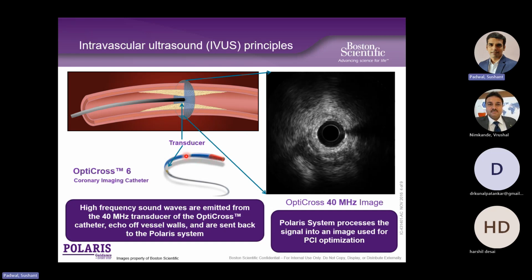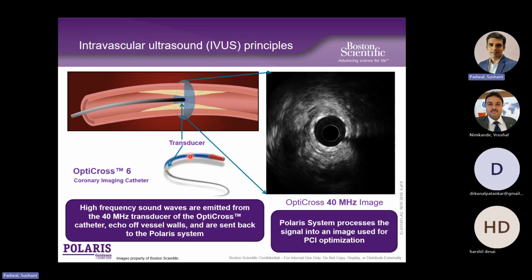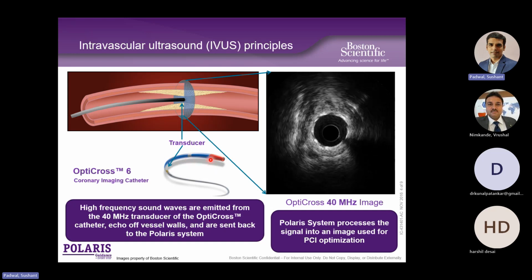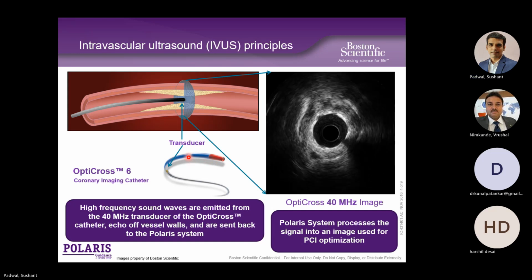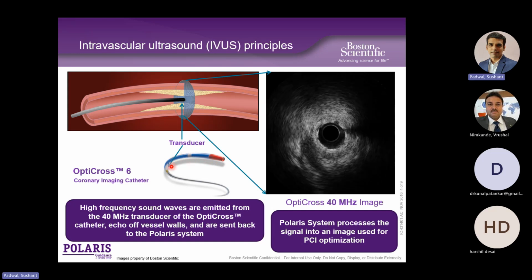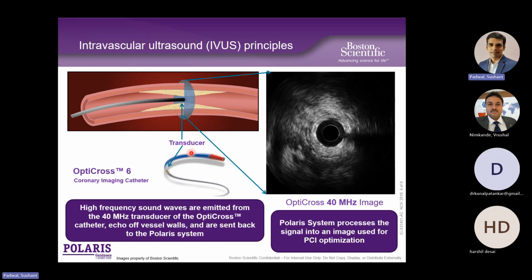Second, other things about the IVUS catheter is that from the tip we have our first radio opaque marker, which is to signify the distal tip, and it is 5 mm from the tip. And the distance between the two markers, that is the distal marker and the proximal marker, is 15 mm.